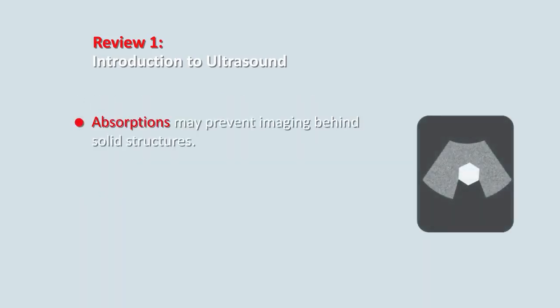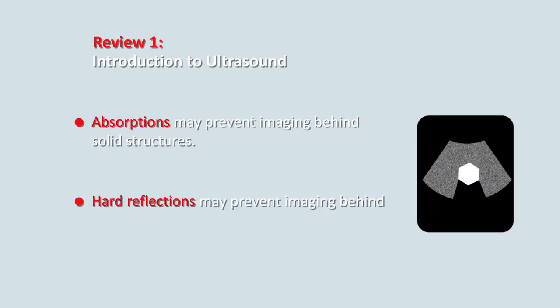Absorption may prevent imaging behind solid structures. Reflection may prevent imaging behind solid structures or air.